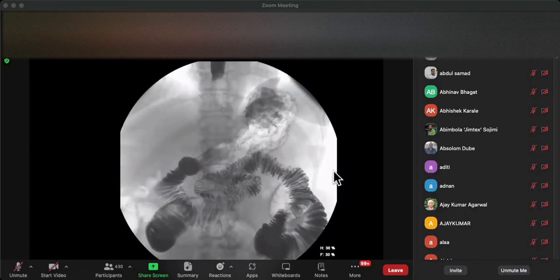Okay, this patient has got a poor malabsorption record, so they're not absorbing stuff very well, and they've got a slow transit of barium through the bowel, and there's a stacked coins appearance, scleroderma. Yeah.